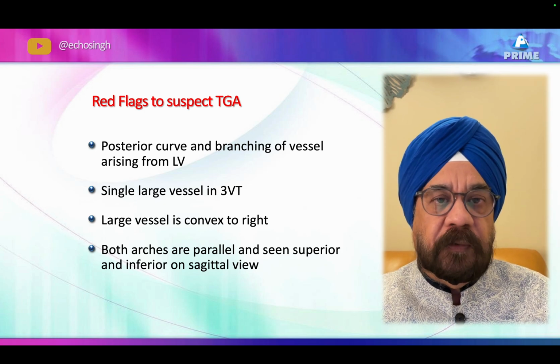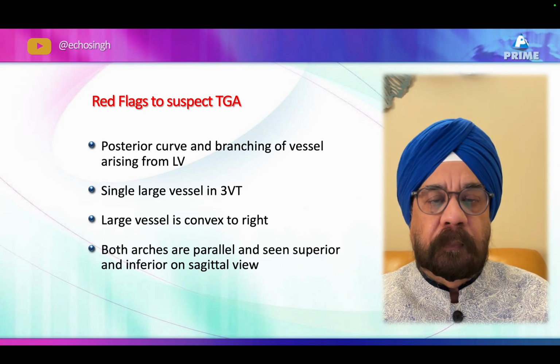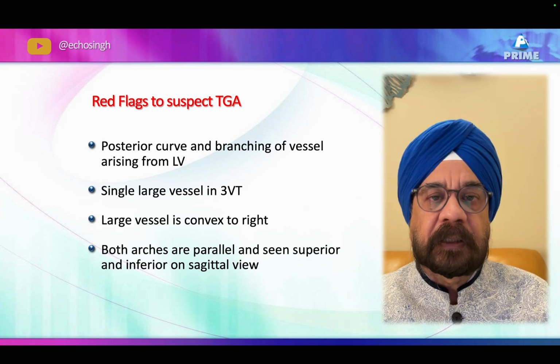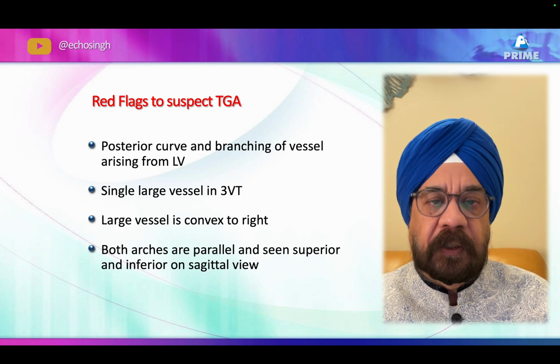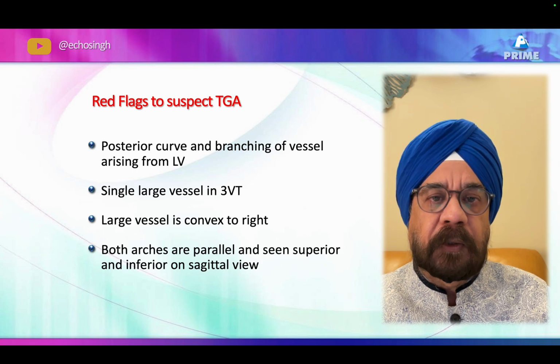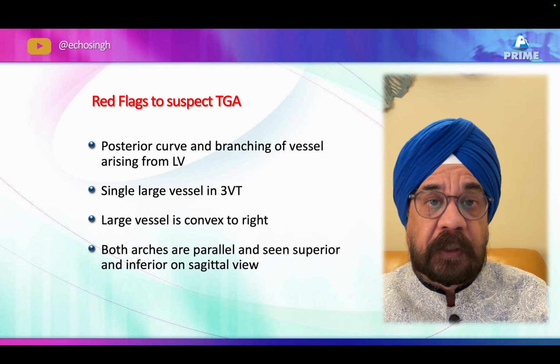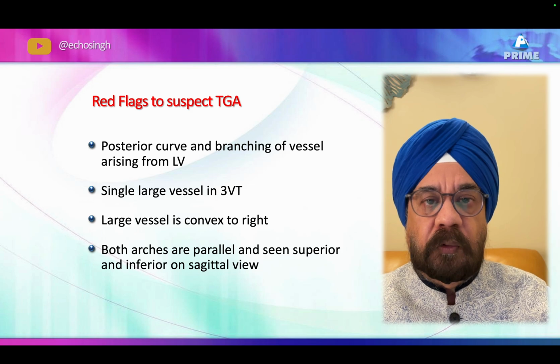So whenever you have a disease with a lot of signs and red flags, you must remember that this disease is difficult to pick up and it's likely to be missed. As a policy, when you have just finished examining a fetal echo, you go back again and look for two things. One is TGA: have I missed TGA? Two, TAPVC. So these two things you must keep in your checklist.